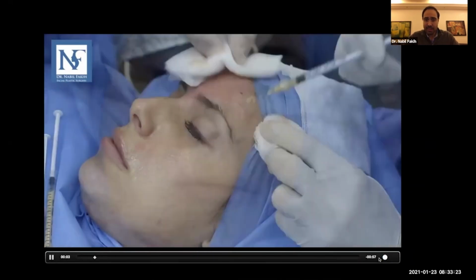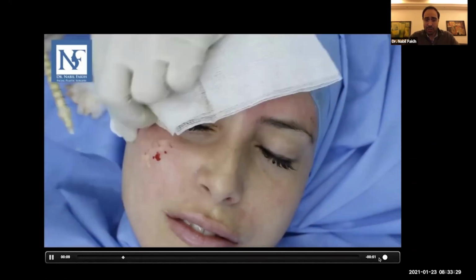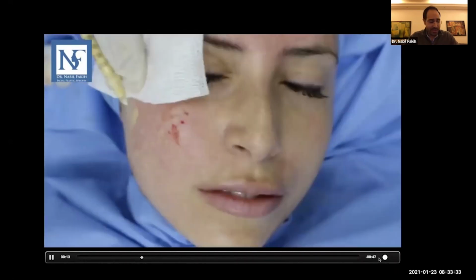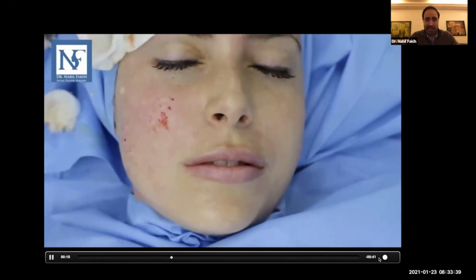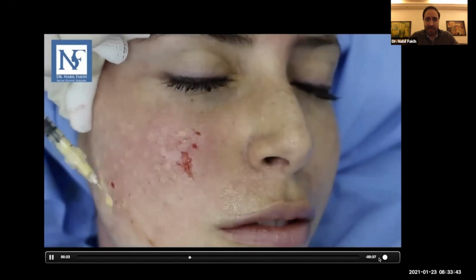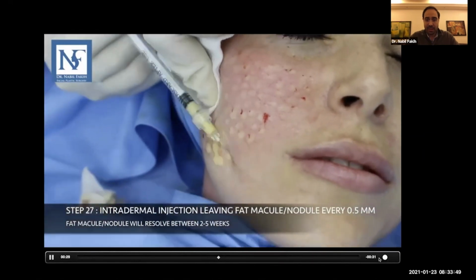And as you see, I'm injecting. You should really leave bumps there in the face, and you should inject it very superficially because the mission is to really improve skin quality. We really need to inject superficially. We should see a yellowish bumpy effect on the skin. If you don't see this, then you're very deep, then less effect you will have on the skin texture finally.